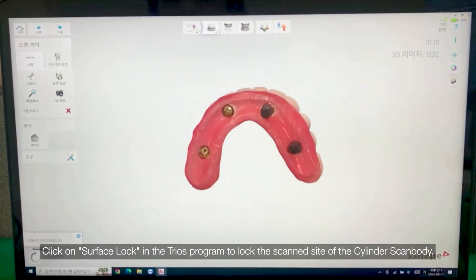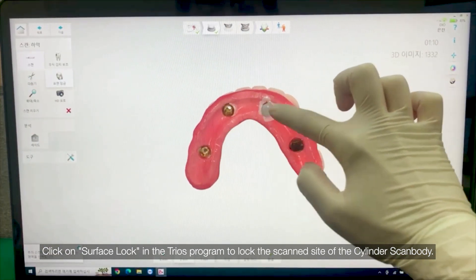Click on Surface Lock in the TRIOS program to lock the scan site of the cylinder scan body.